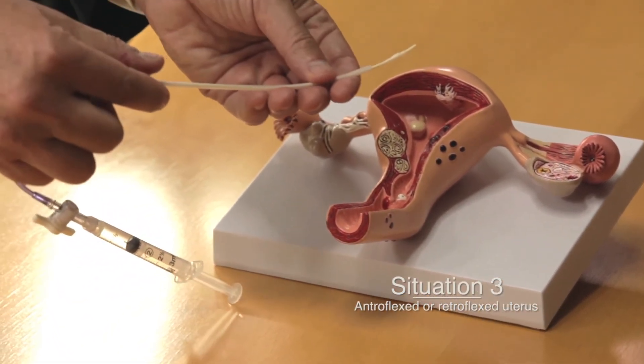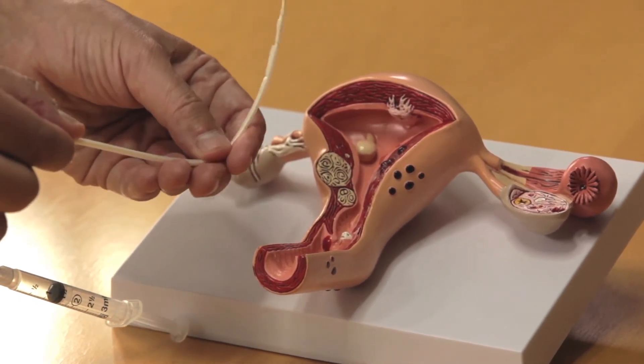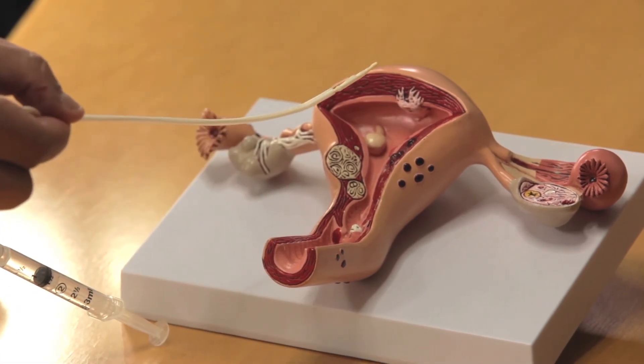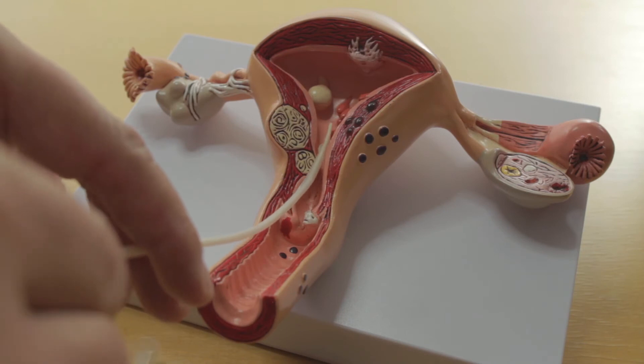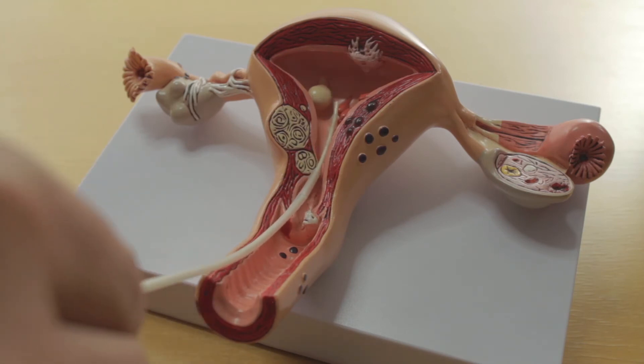The third concern would be the patient who has a very anteroflexed or retroflexed uterus. In this case, we make use of the memory feature of the catheter sheath. As you can see, I'm flexing the catheter sheath so that I can get virtually any angle I want. I then come in through the vagina, on inside, and inflate the balloon.